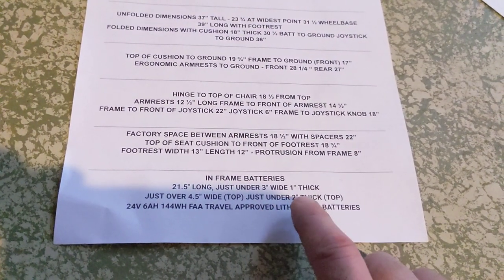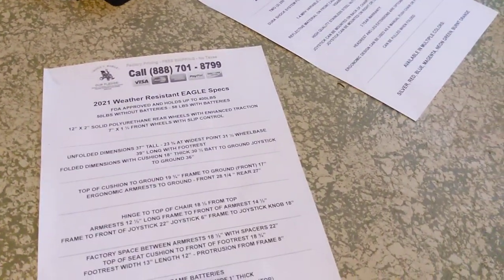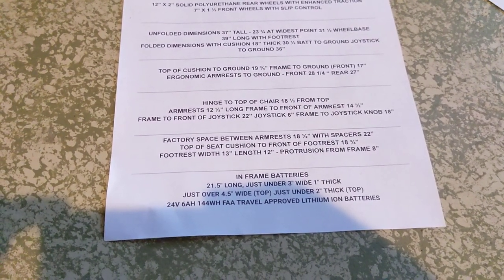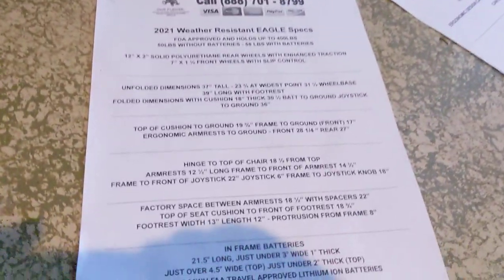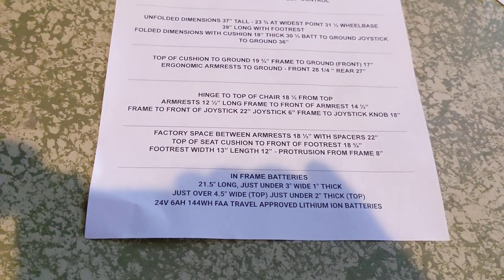The in-frame batteries are 21.5 inches long, just under 3 inches wide, and 1 inch thick. They are 24 volt, 6 ampere-hour, 144 watt-hours each, and are FAA-approved lithium-ion batteries. The top of the battery — the black part where the handle is — is just over 4.5 inches wide and just under 2 inches thick.